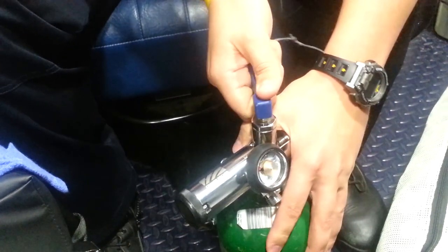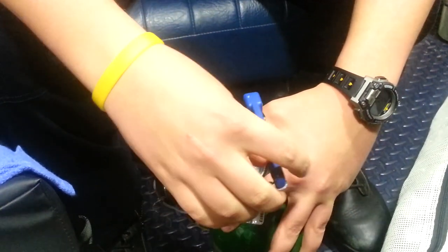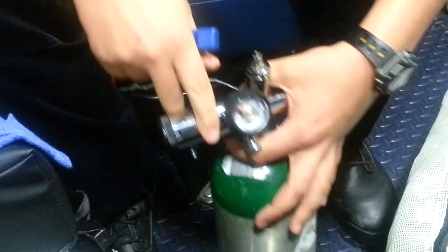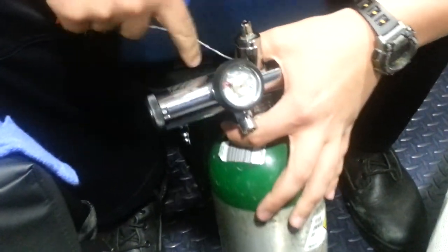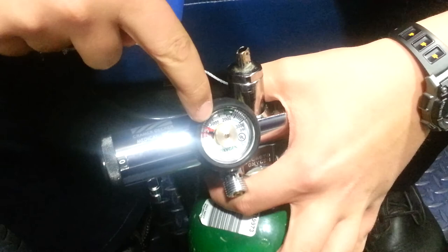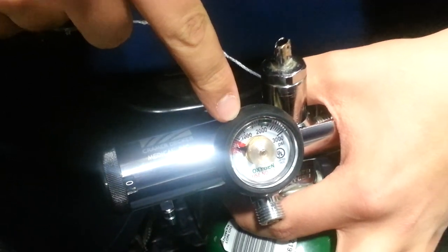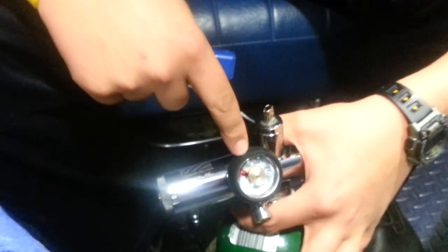It's righty-tighty, lefty-loosey, and all you need is enough just so it's a little loose. On this tank, we see that it's empty, so I'm going to show you how to change the main oxygen tank, or the portable oxygen tank.